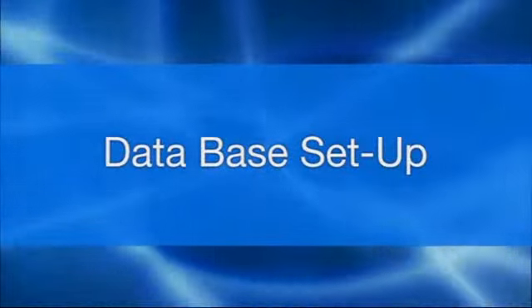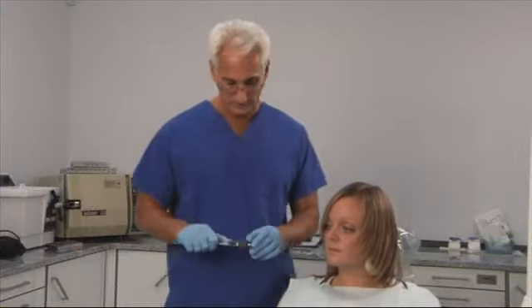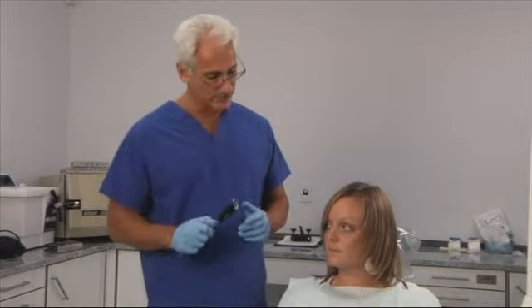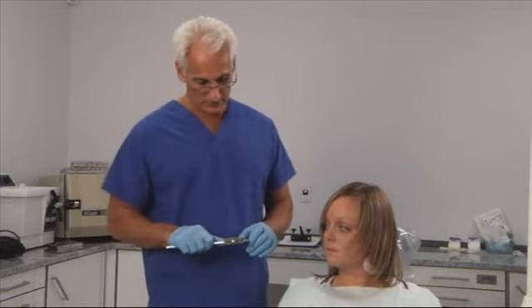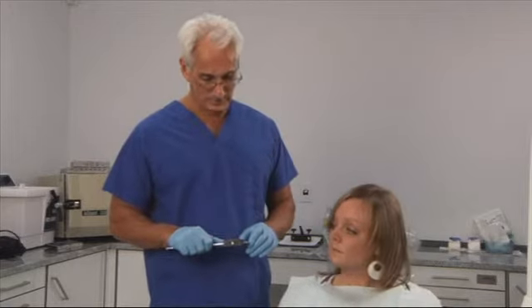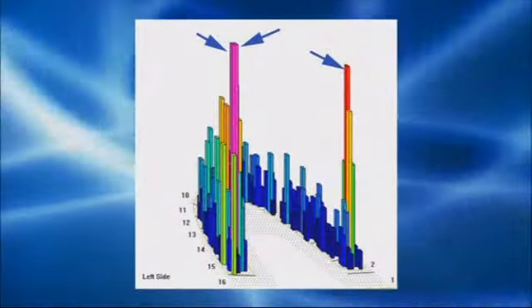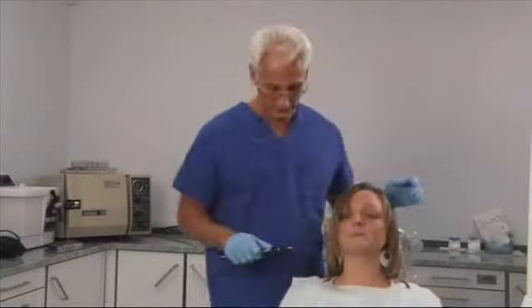So the first thing we have to do is set up a proper dental arch for you, and that involves measuring your central incisor width, which we'll do with this digital caliper. And then we'll choose a proper recording sensitivity for your bite strength, which allows us to record accurate force information. To do that, we like to have only a few, 3 or 4, red or pink cells on the sensor. Okay, so put your head back for me.